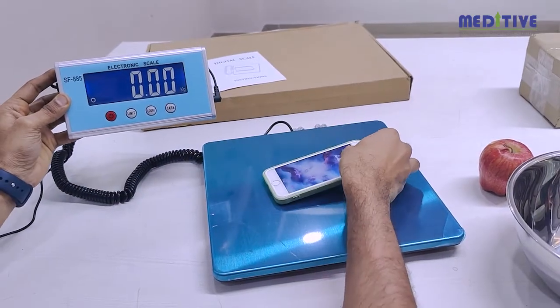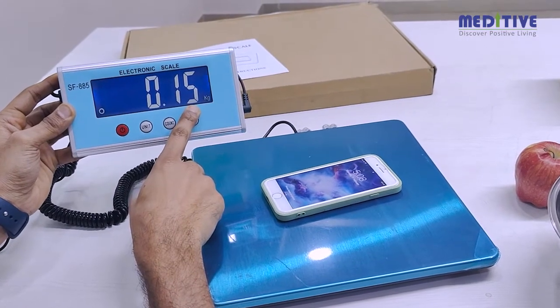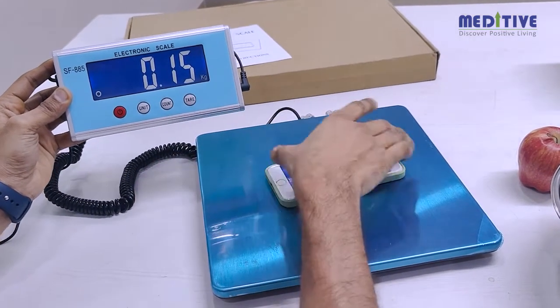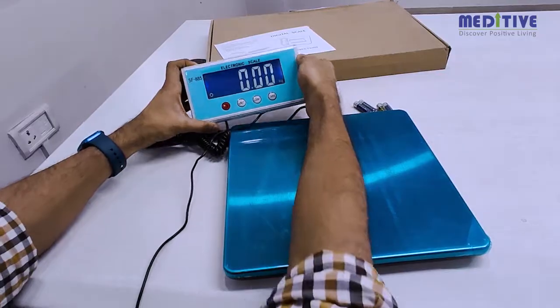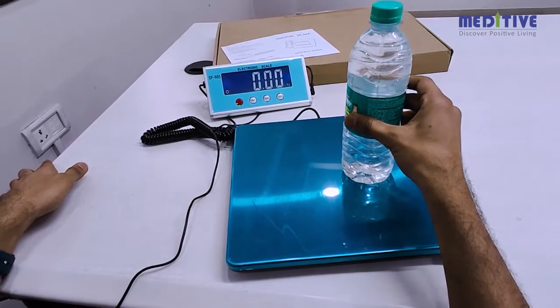For example, if you put any object weighing 670 grams, it will either display 650 grams or 700 grams. The scale is suitable only for weights between 150 grams and 75 kilograms.